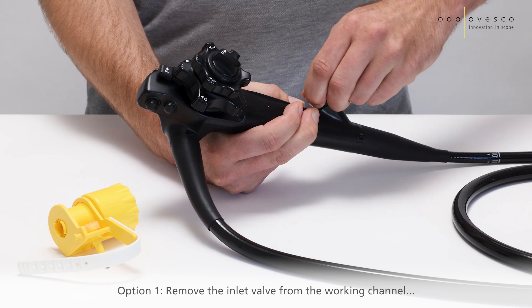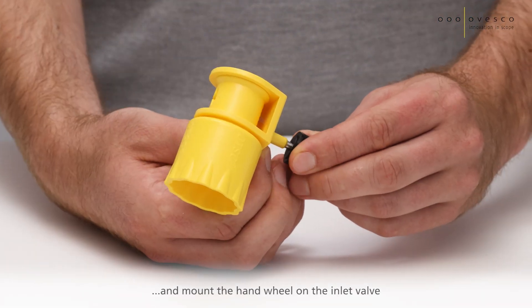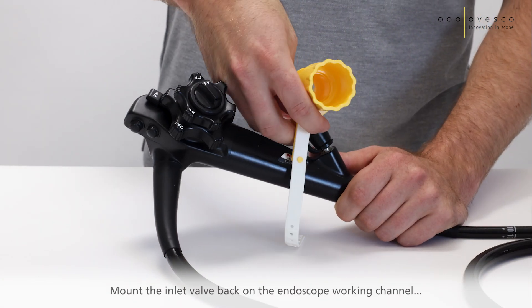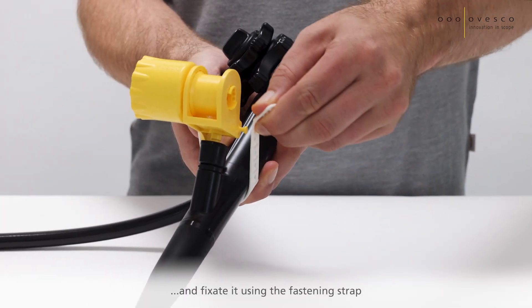Option 1: Remove the inlet valve from the working channel and mount the handwheel on the inlet valve. Then mount the inlet valve back on the endoscope working channel and fixate it using the fastening strap.